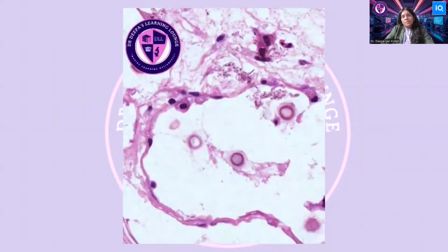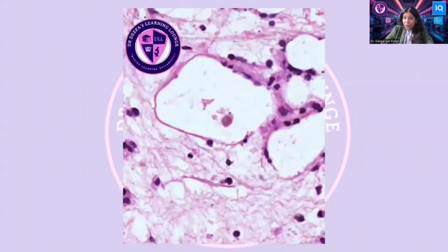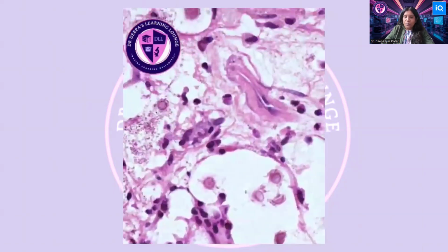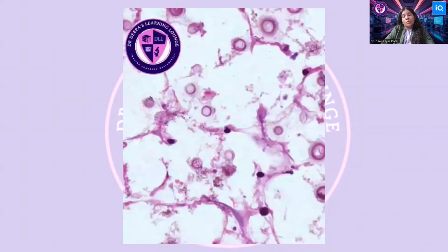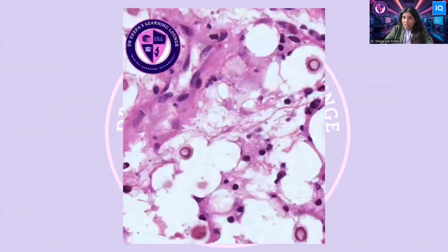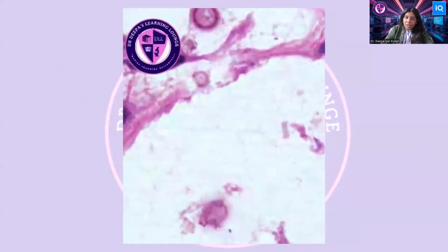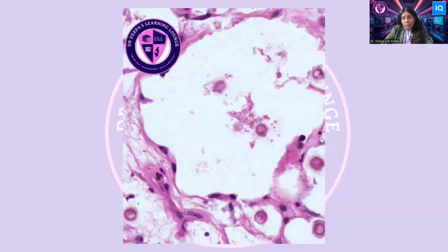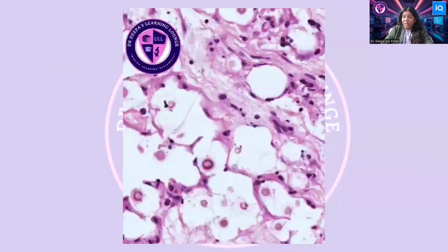One of the most important diagnoses to recognize in cryptococcal meningitis is its differential as well. You just can't jump to the conclusion that it is cryptococcal meningitis from one histological section. I will tell you that several fungi and protozoal organisms can mimic Cryptococcus histologically. So today we will discuss the important differential diagnoses, learn how to distinguish them microscopically, and review the three stains used to arrive at the diagnosis of cryptococcal meningitis.